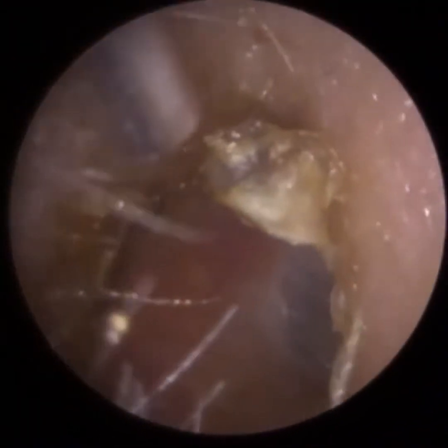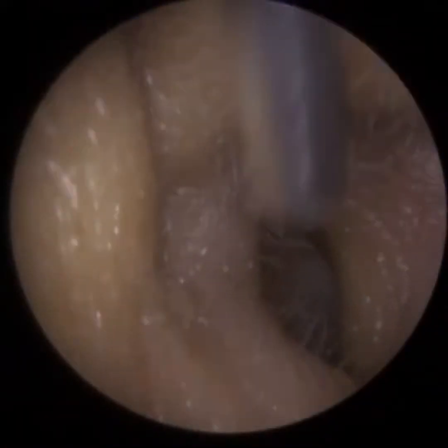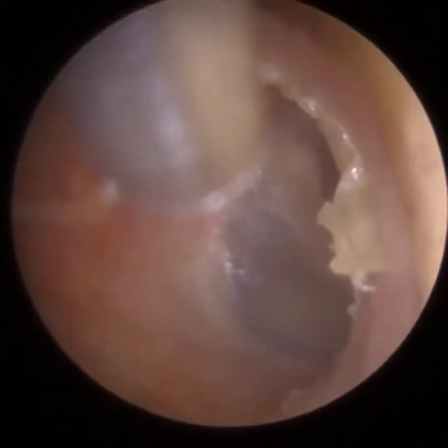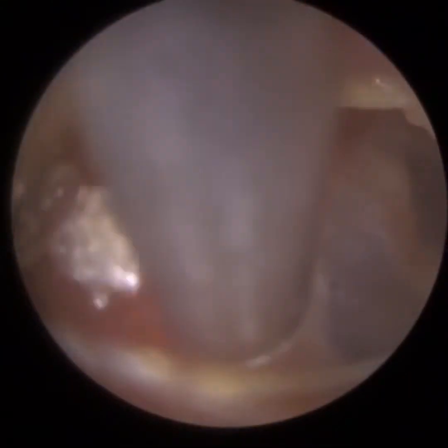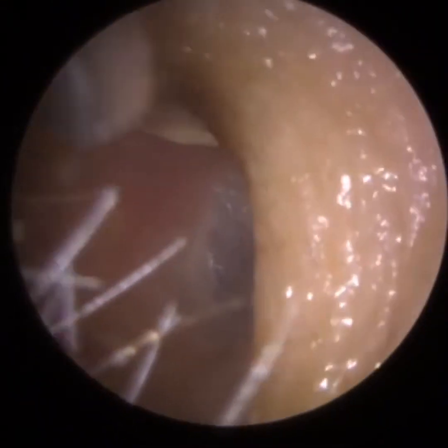So the patient's got a nice healthy ear canal. I just wanted to mop up some of this dead skin because it was quite lateral. Again, I was just telling the patient to remain as still as possible. And there's a bit of dead skin a bit further in here. I'm just trying to hover over that, and I wasn't going to go for any of that deeper layer of skin. So there's some dead skin a bit more lateral near the entrance. And again, I was using a fine gauge here, so it's less noisy for the patient.